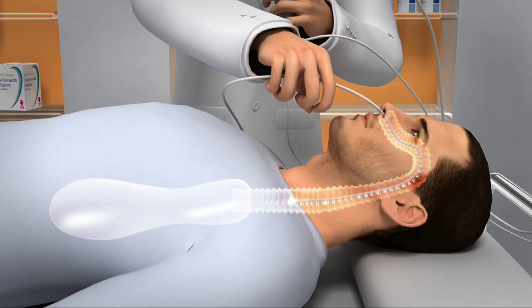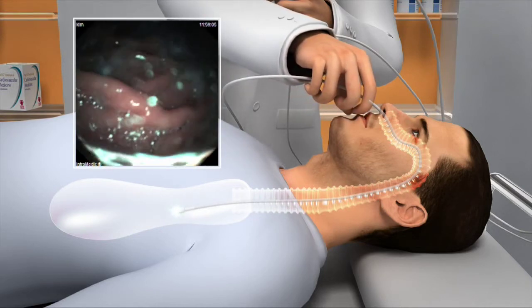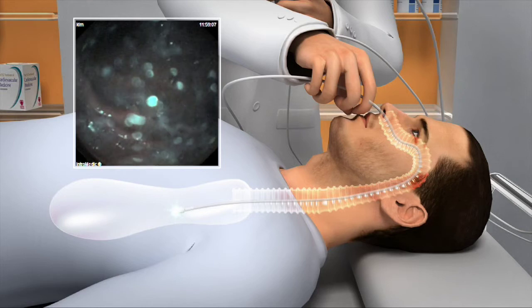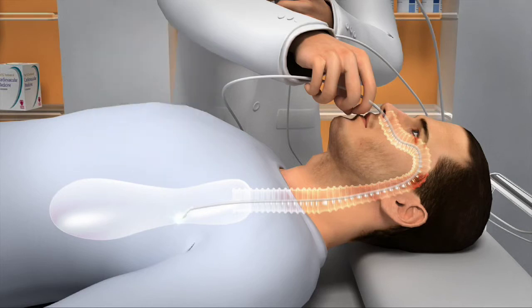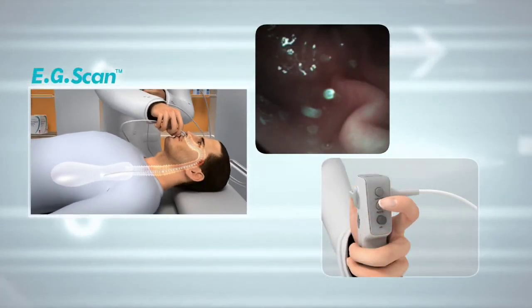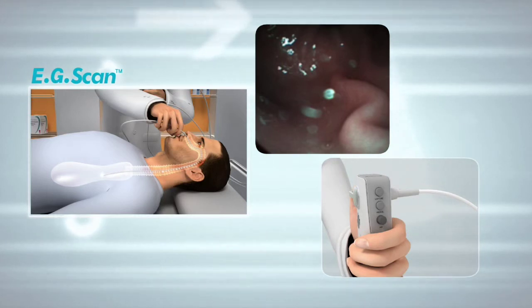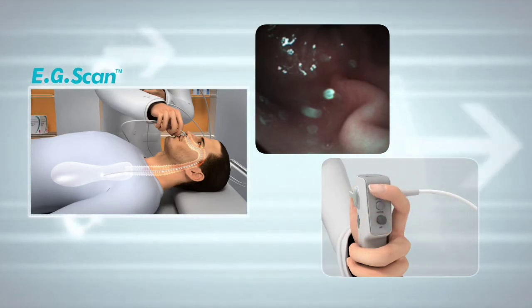When the probe passes through the esophagus, let the patient swallow the saliva. Be careful not to stray out the end of probe from the esophagus and insert probe inside the esophagus. If you press the freeze button, then the screen will pause. At this moment, the user can save the frozen image by pressing the capture button.